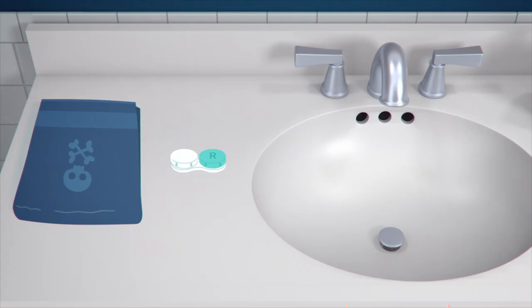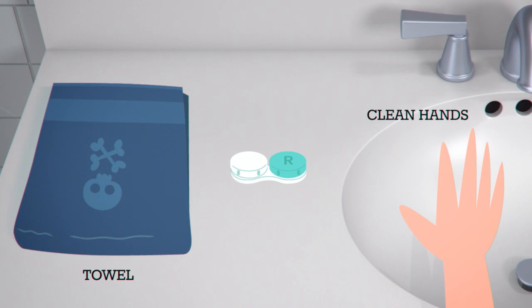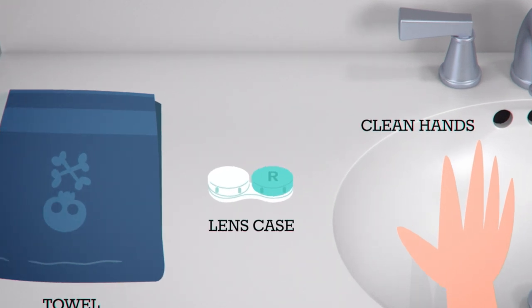Here's what you'll need: clean hands, a solid coloured towel — lint-free if you have one — and your lens case. You won't need a lens case if you wear dailies.